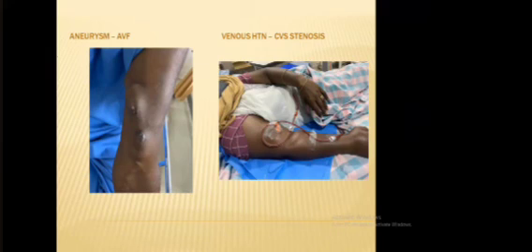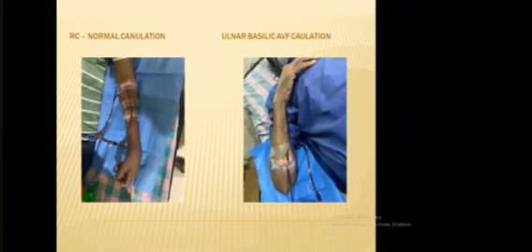These are the problems. Still we can do the dialysis through this, because the patient is asymptomatic other than this severe edema of the upper limb.